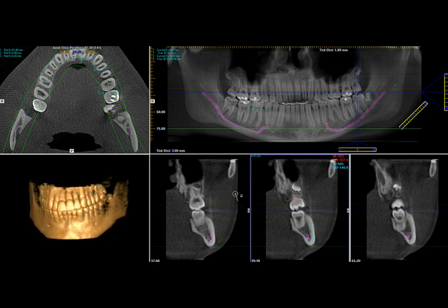And that could be incorporated as part of the patient's implant costs, and you can let them know, hey, I can show you. So it'll be well worth it for them. If you actually show them their own CT scan and show them what you're doing, it'll be worth it for them, and maybe even worth it if they want to get implants later on. And especially if you're doing a multi-implant case, that 250, 300 cost is so well worth it.